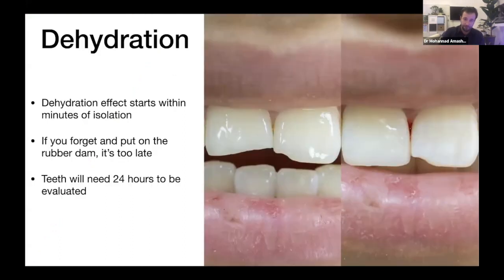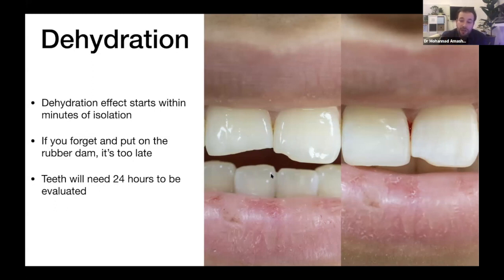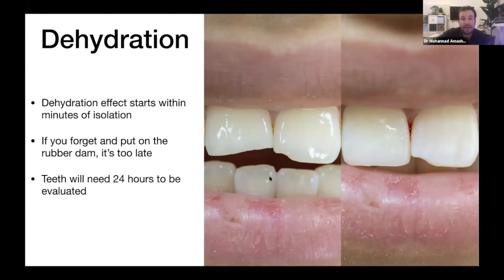We chose to start with shade matching because of the dehydration effect. Dehydration starts immediately — you can see how the color becomes opaque and white lines appear right away, whereas in the same tooth before dehydration it was not apparent at all. That's why you have to take your shade selection immediately when you see the patient, sometimes even before you do anything else, even before placing rubber dam. If you place rubber dam first and take the shade later, it's too late — you'll have to wait 24 hours for the shade to return.